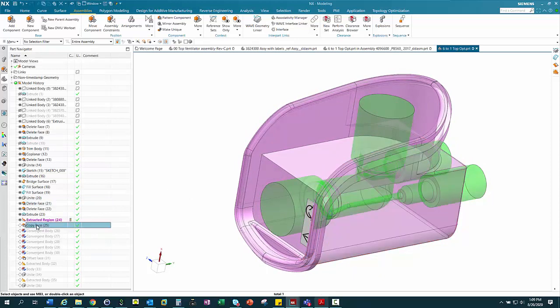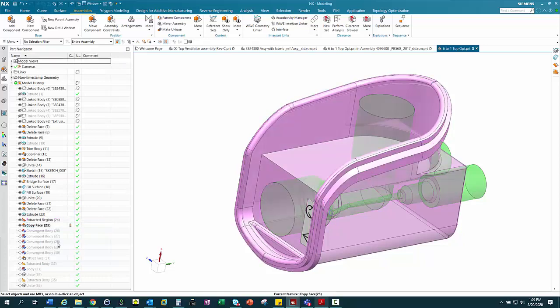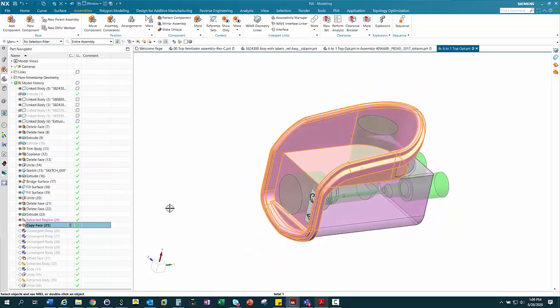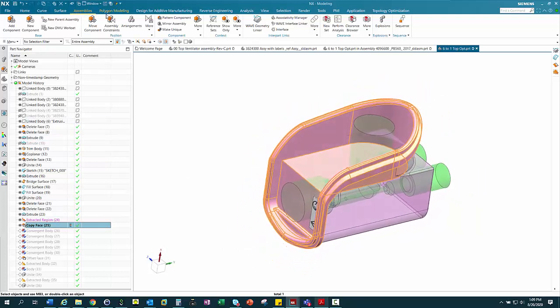And now a very important part, this here, that is the outside shape, because the part still needs to fit in. So we're going to tell it that you have to stay within this design space. This is the airflow that we need, and you have to match the old part in this area. And by doing all of that, we're able to run the topology optimization, and we'll do that next.